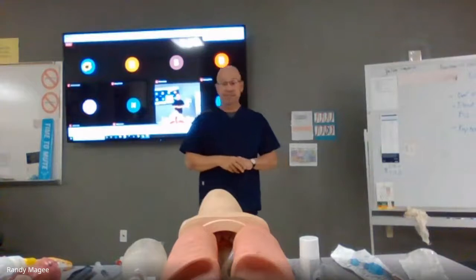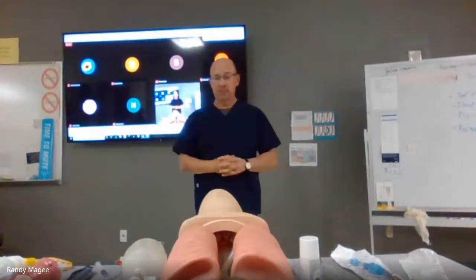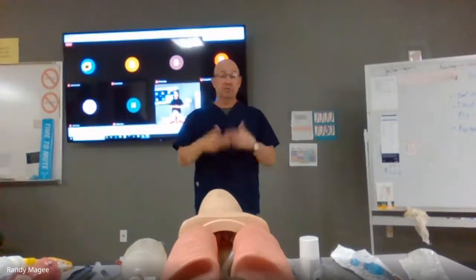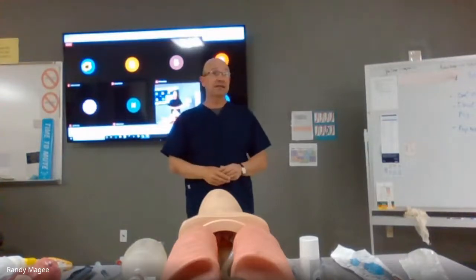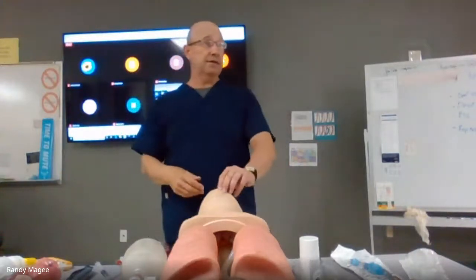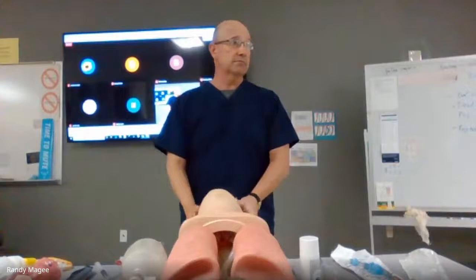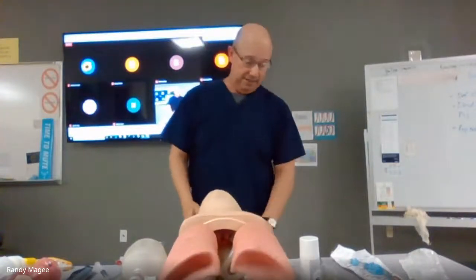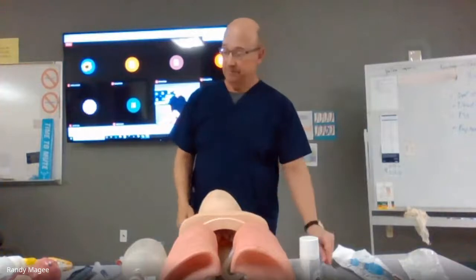Okay. And then you get into other problems where you could actually destroy the soft tissue. You could break the teeth. I'll show you that in a second. Okay. You cut a lip. I've cut lips before. It's not that big a deal. The patient's not breathing. A cut lip is minor, but you don't really want to do that.